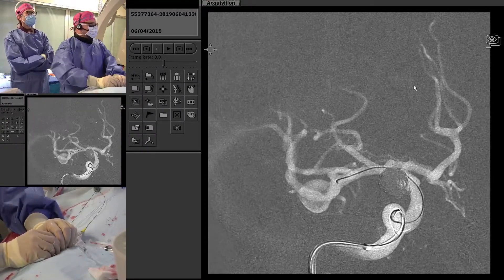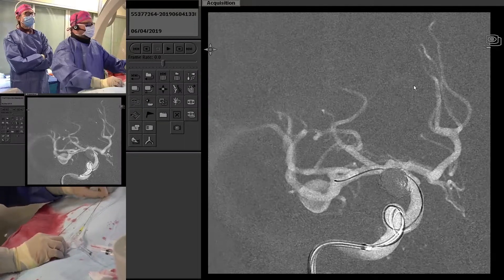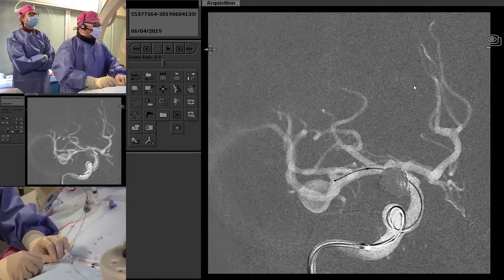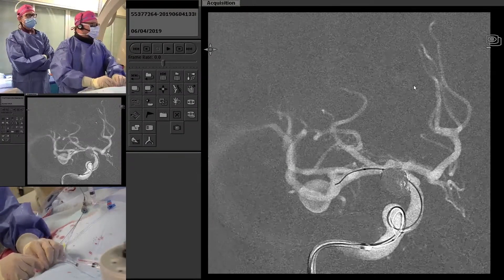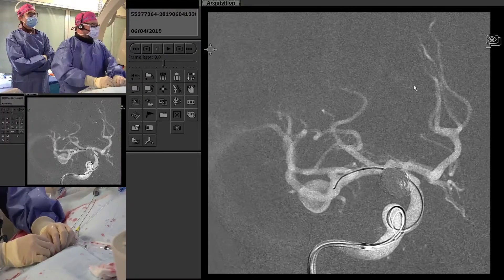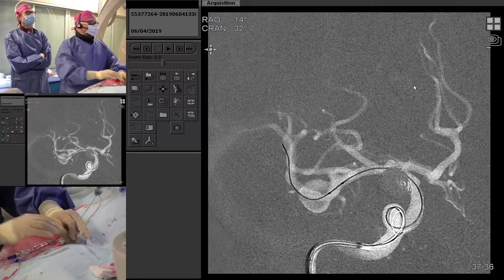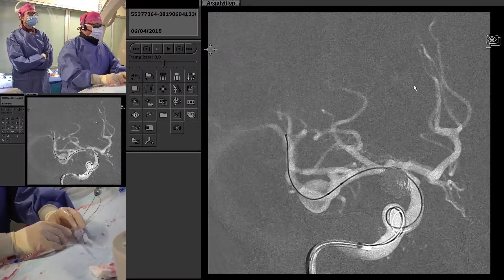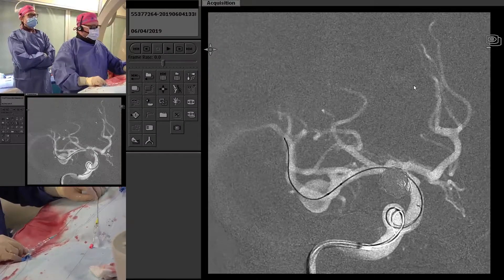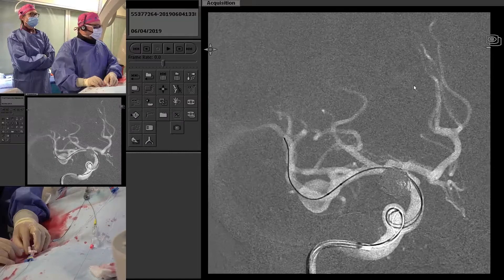The wire has a little bit of play on it, so I'm going to pin it and bring the balloon up a little higher. Many wouldn't balloon this — it's a reasonable neck-to-dome ratio. But she has a complicated medical history, and when her PCOM aneurysm was coiled, although there was no untoward event, she did have a little bit of extravasation and we had a balloon in place that completely managed that. We now have the balloon positioned across the neck of the aneurysm. Intracranially, we only move one wire or microcatheter at a time.